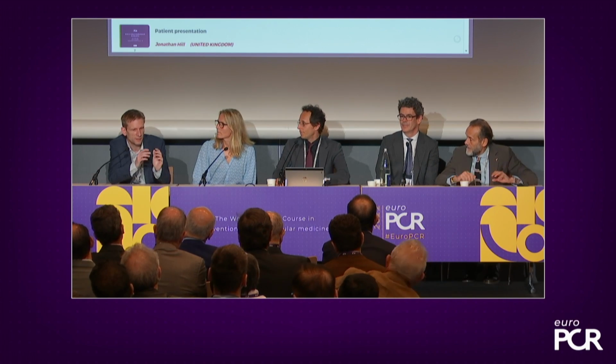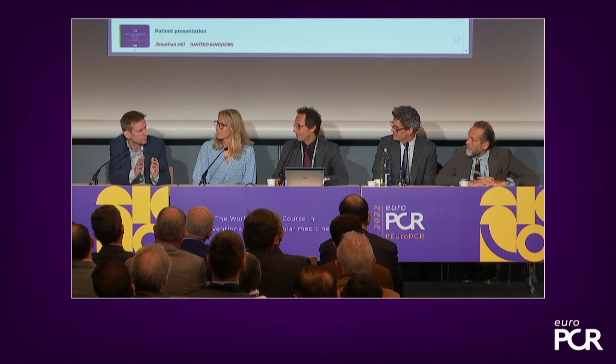Exactly. What's important to say is that Ole maybe will show us that the peripheral balloon of shock wave has already changed. You can make more inflation in less time. I think that they will improve the same in the coronary field. This is very, very important in these cases too. Yeah, the time actually got cut in half. So you can give the pulses, typically in the peripheral, you have 300 cycles. Per cycle you can give 30 pulses. In the past it was basically 1 second per pulse, took you 30 seconds. Now you can give the same energy, 30 pulses in 15 seconds. In 15 seconds. Yeah. And that's important. Absolutely.